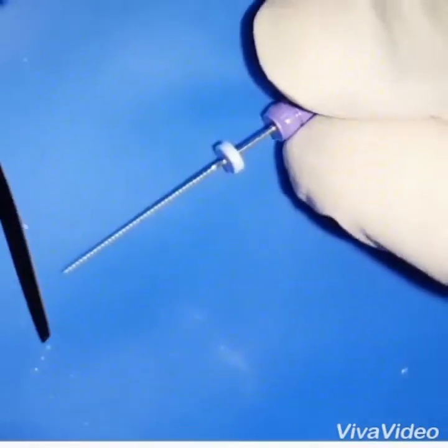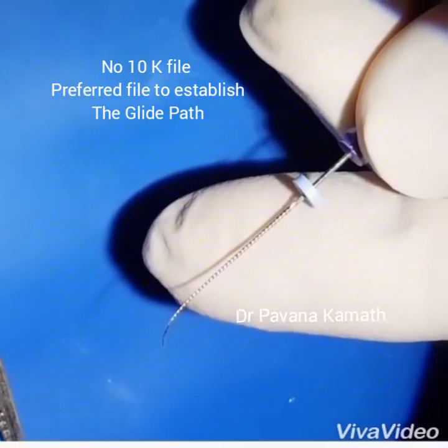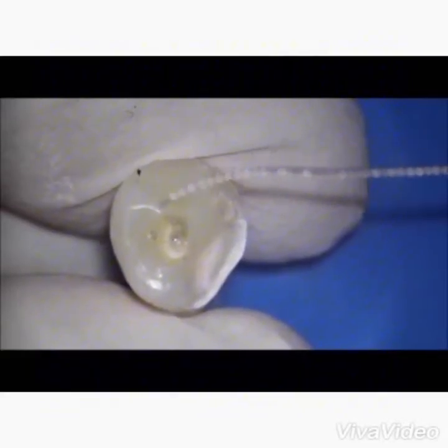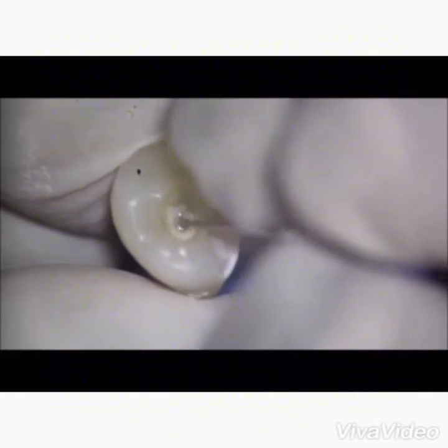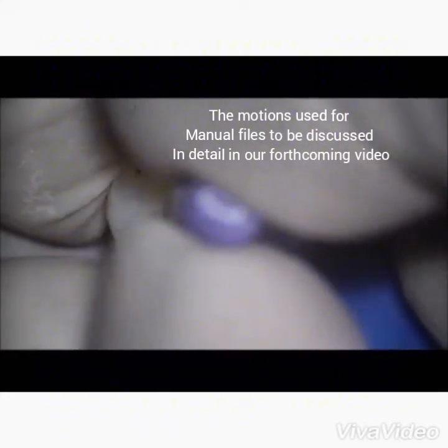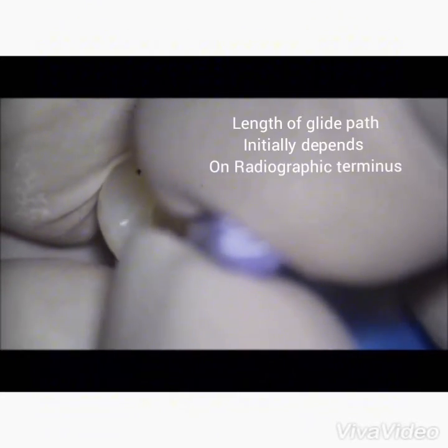The number 10 K-file is pre-curved in the apical third using simple cotton pliers. The pre-curved file is now used to establish the glide path. Place the file into the canal and follow the canal — you will feel the file slip, slide, stroke, and trail through the walls of the canal.